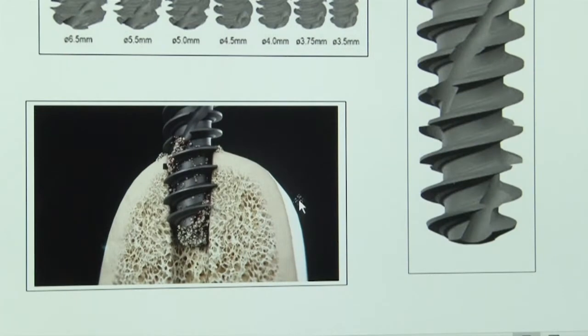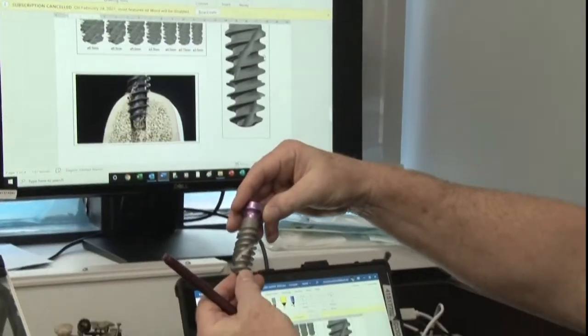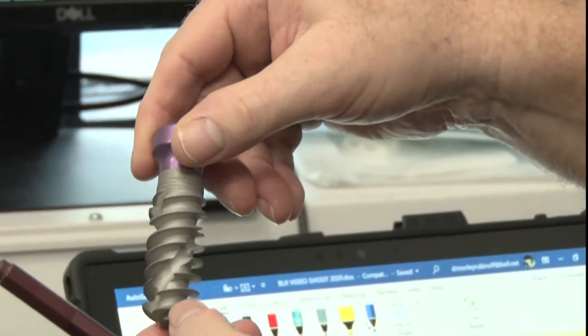The BLX implant reminds me of a wood screw, a screw going directly into wood, and it grabs as it goes down. The thread pitch that you see here is very aggressive as it grabs onto bone. But there's something else that's very interesting. These grooves are on both sides. Follow on the implant here. There's one groove there, and then there's another groove there.